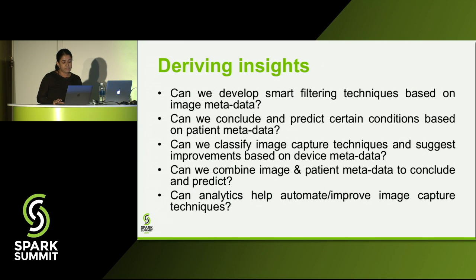Can we combine image and patient metadata to conclude and predict things? This is fairly important because right up till now, we spoke about handling image data separately, and we spoke about handling patient metadata, that is your health record, separately. So can we combine the two?